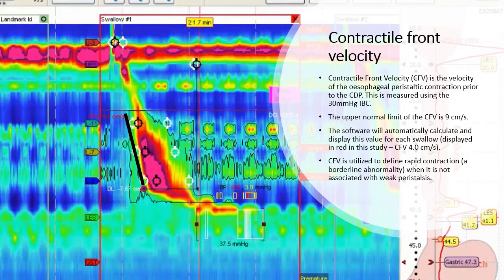The contractile front velocity is the velocity of the esophageal peristaltic contraction prior to the contractile deceleration point. This is measured using the 30 mm isobaric contour. The upper normal limit of the contractile front velocity is 9 cm per second.